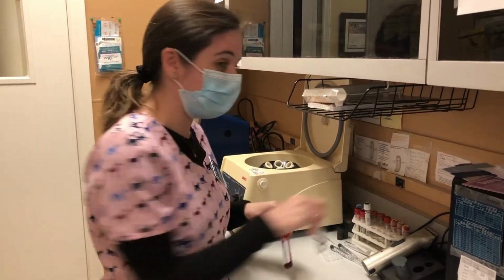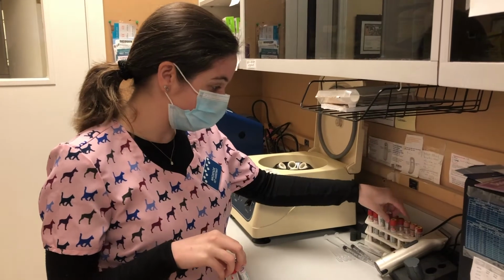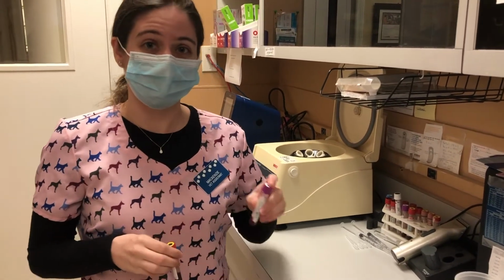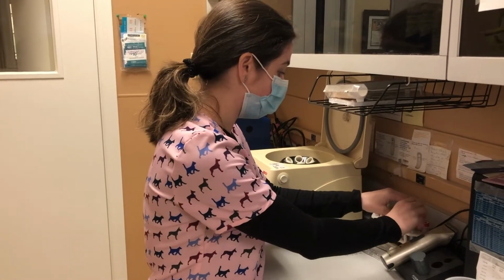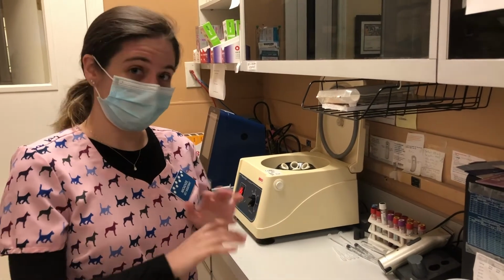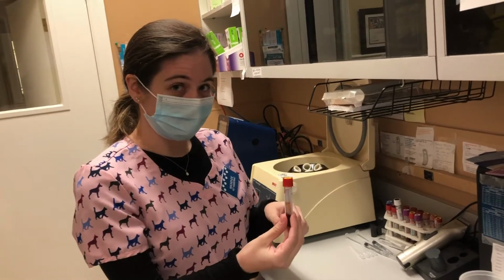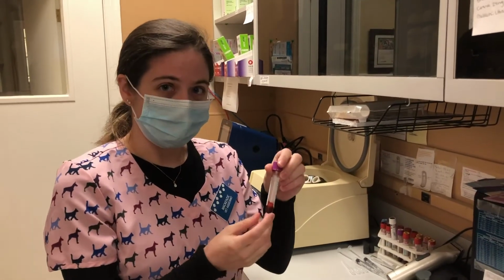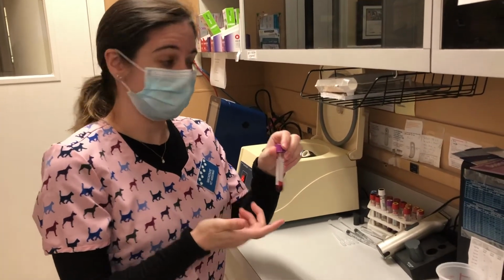As you can see, I've already gotten my blood. I have my clotted blood with my serum in my red top tube, and I have my anticoagulated whole blood in my EDTA tube. I've already done this step, but you want to centrifuge all four of your tubes. So I have my serum from my clotted blood, and then I have my plasma and my packed erythrocytes, or red blood cells, at the bottom of my EDTA tube.